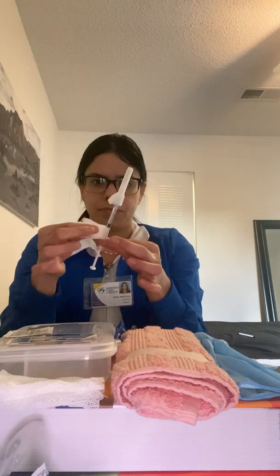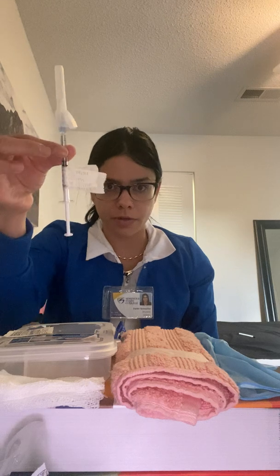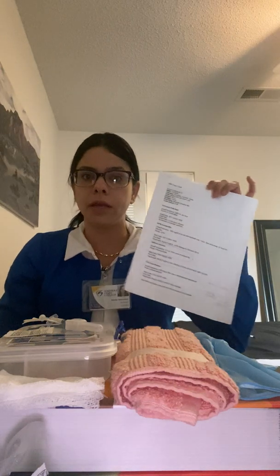Okay, and I have it. So now I am ready to go and administer this medication to the patient. I would go to the patient's bedside, and I am going to use my medical record, my chart right here, and identify my patient using two identifiers, which is Anna Pawlowski and the date of birth, May 5th, 1957.